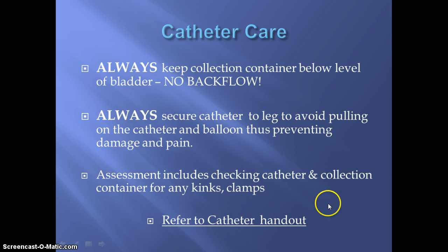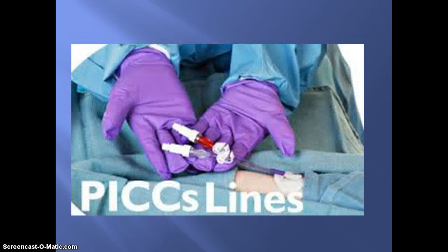Assessment always includes checking the catheter and collection container for any kinks or leftover clamps that have been left on there. So please be cognizant of this, and it's good practice. It's just plain good practice.